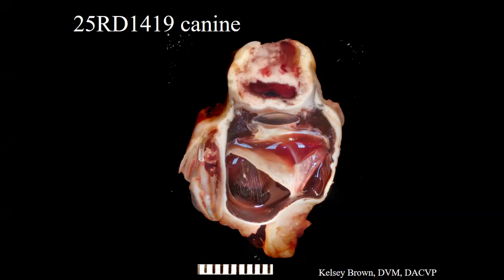So over the past year, this eye had cataract surgery. You can see a little intraocular lens in place right here. It had endolaser performed twice, so a cyclophotocoagulation for glaucoma. It also had 2 Ahmed valves or gonioimplants placed, which I'll point out the structures of once I finish with the history. They described forward displacement of the intraocular lens. A gentamicin ablation was performed at one point as well.